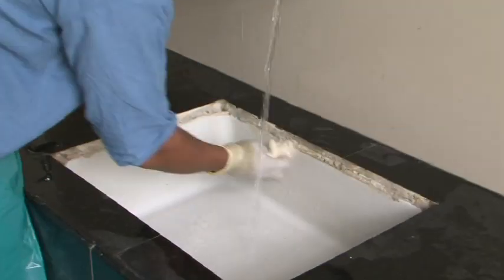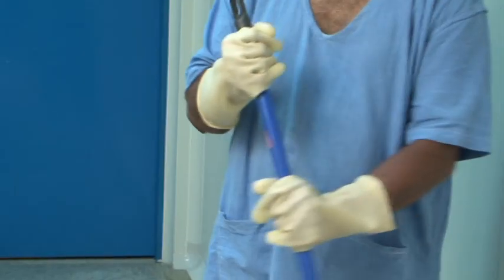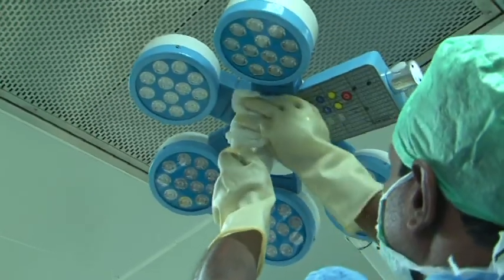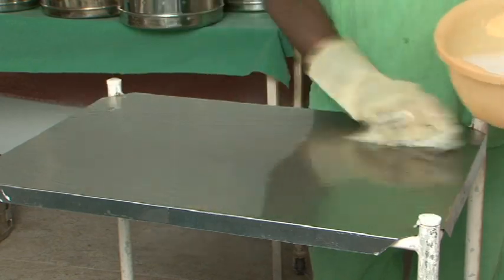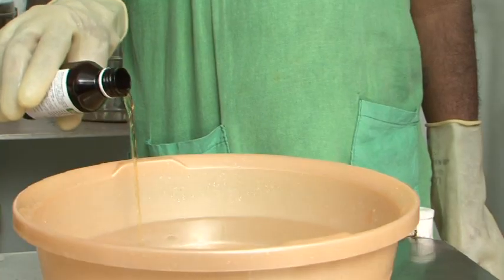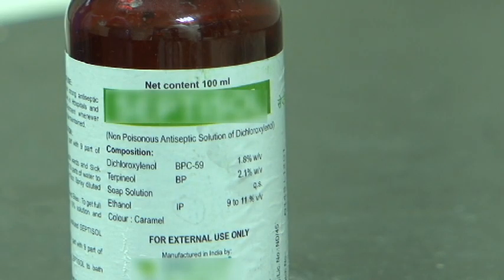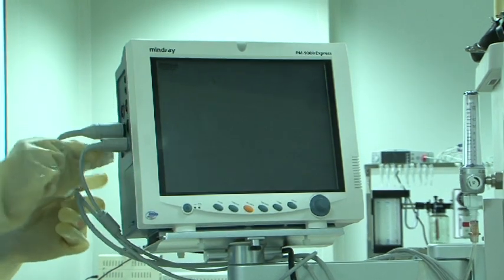Clean the floor and sinks with detergent or soap water and keep the floor dry. Clean tabletops and other surfaces like light shades, almirahs, lockers, trolley, etc. with low-level disinfectant phenol, that is, carbolic acid 2%. Clean monitor machines with 70% alcohol.